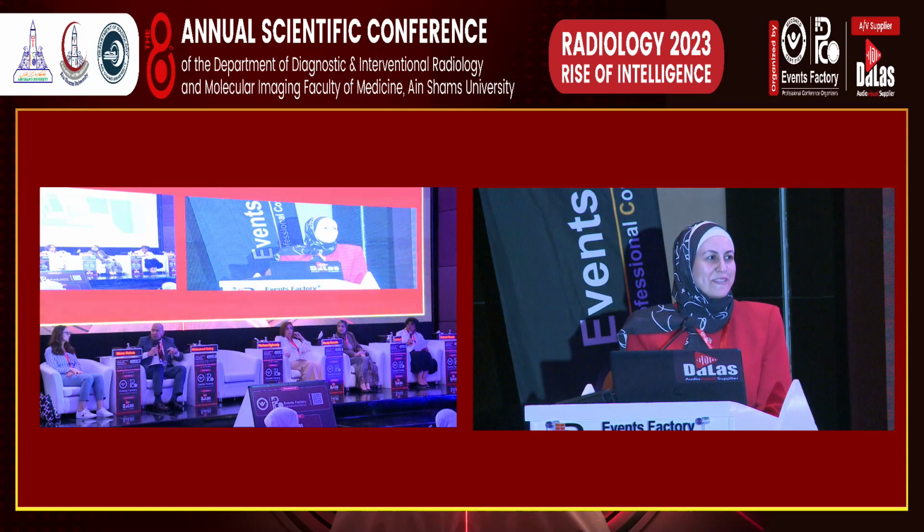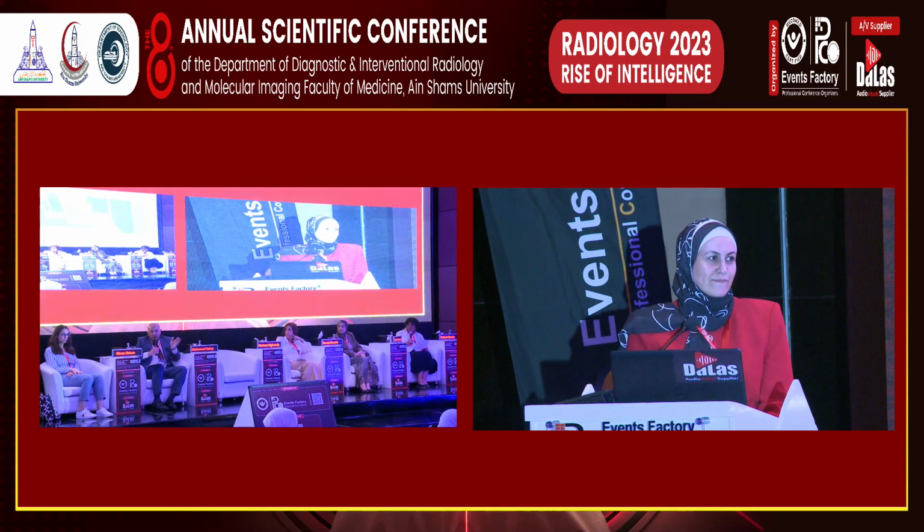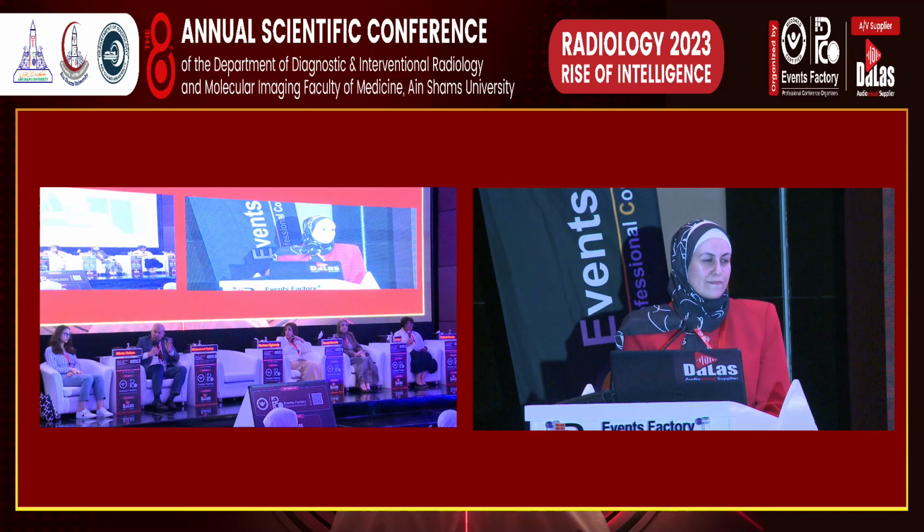Yes, this is the recommendation of the NCCN guidelines for initial staging. Patients should do PSMA PET before treatment, not in between treatments, and it may be tricky because it can denote that the patient has more mets. But the value of PSMA PET is to do it pre-treatment and post-treatment. Another issue is that we depend mostly on PSMA PET for delineation, because we have the STAMPEDE trial.